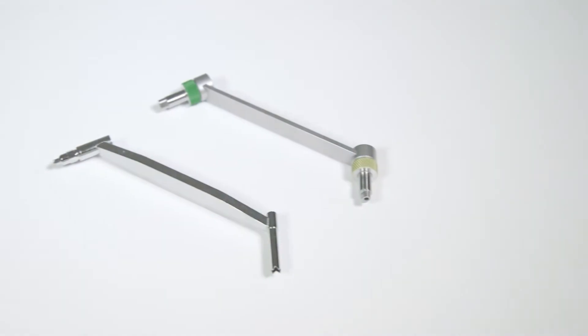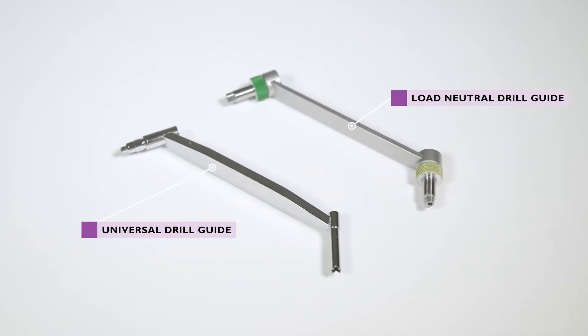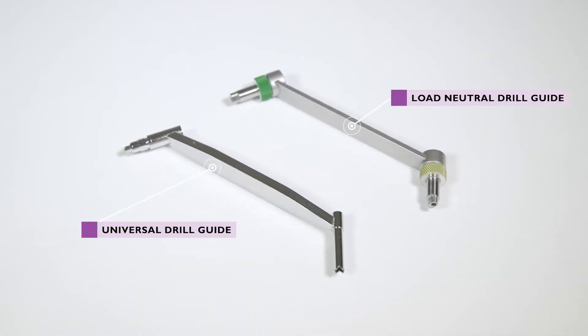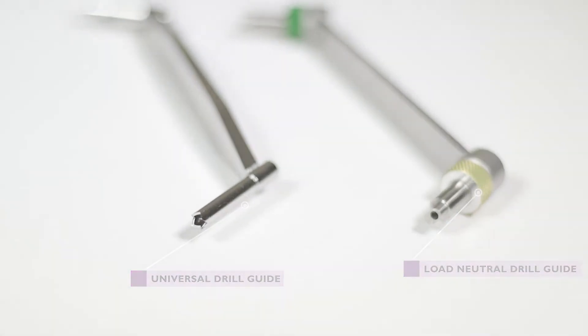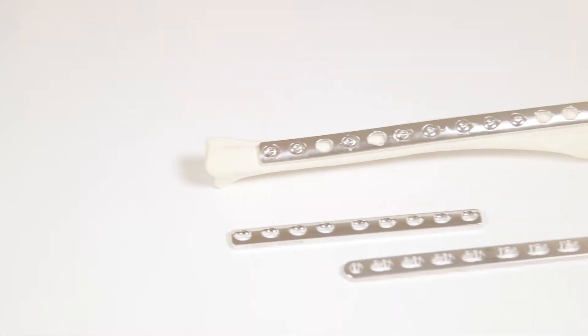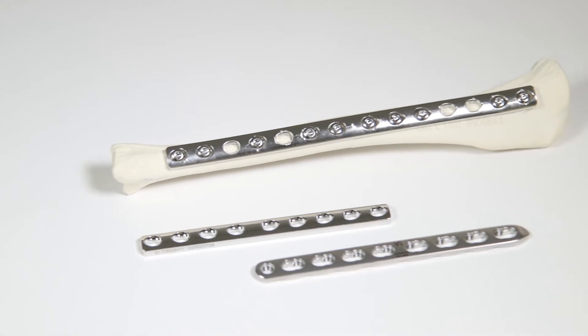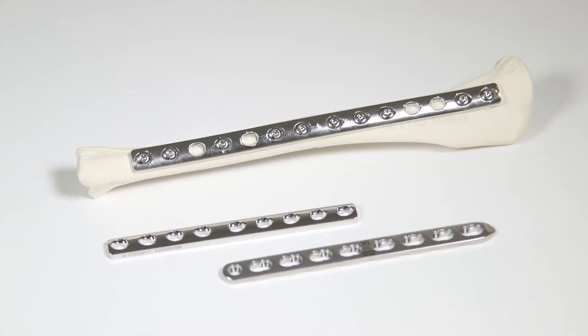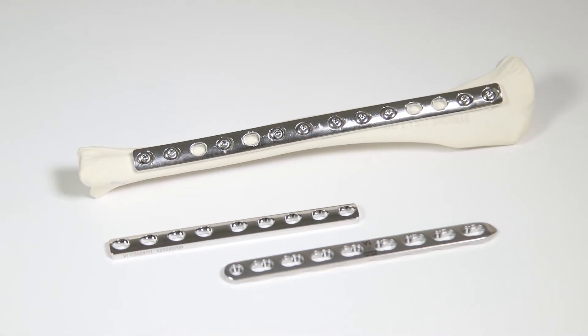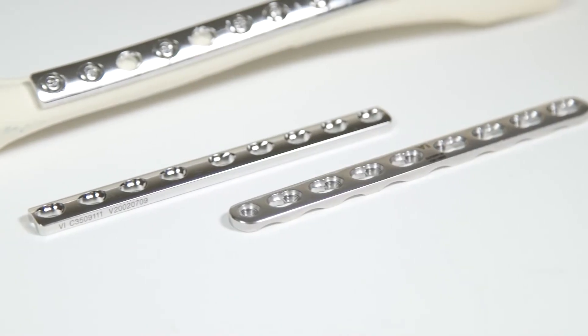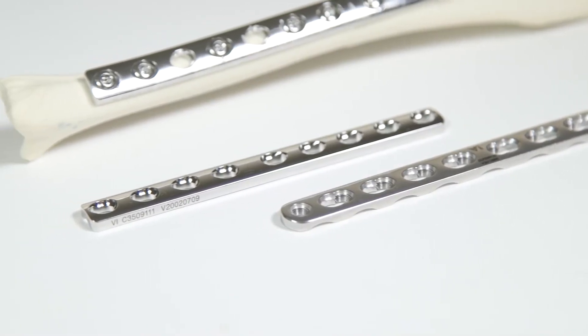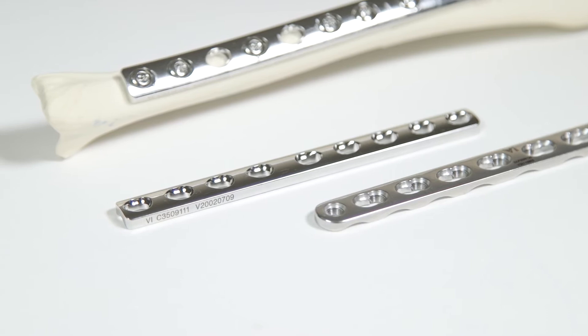These devices are used to achieve accurate placement of pilot drill holes when placing a plate in compression mode. Correct screw placement is essential to creating axial compression across a fracture. The Load Neutral Drill Guide and the Universal Drill Guide help achieve accurate screw placement.